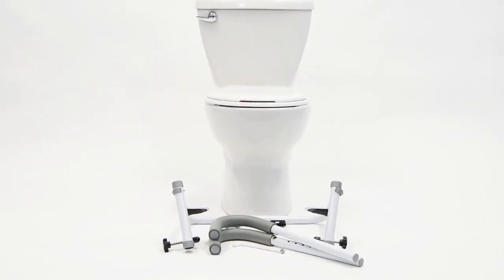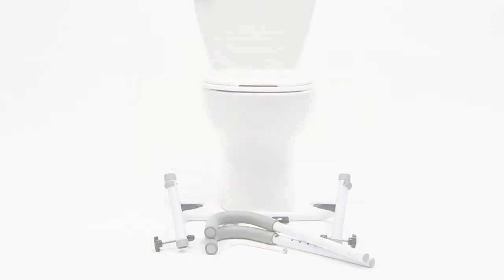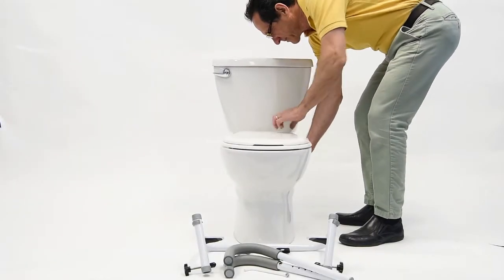Introducing the latest innovation from Mob Healthcare, the Ultra Toilet Safety Frame. The Ultra Frame is a marvel of simplicity, versatility and strength.